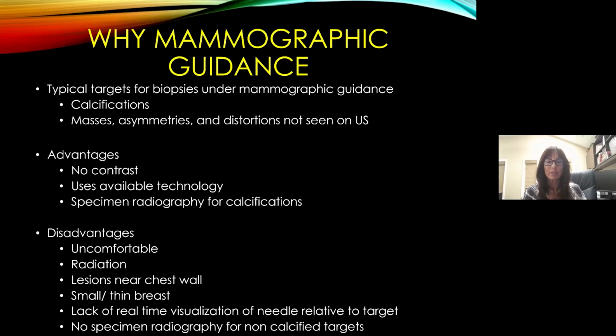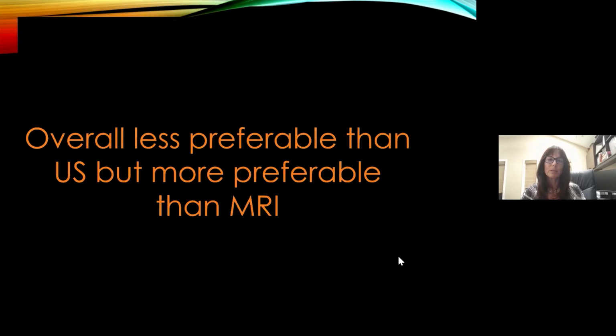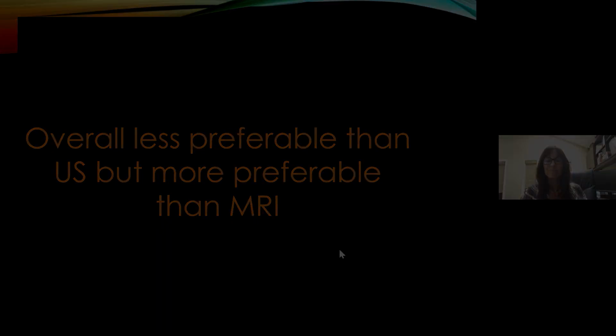under mammographic guidance. We also don't have the real-time visualization of the needle in the target, which you would have with ultrasound guidance. And also, if the target is non-calcified, there's no way to confirm with a specimen radiograph that you've been successful. Overall, mammographic-guided core biopsies are less preferable than using ultrasound, but more preferable than utilizing MRI.